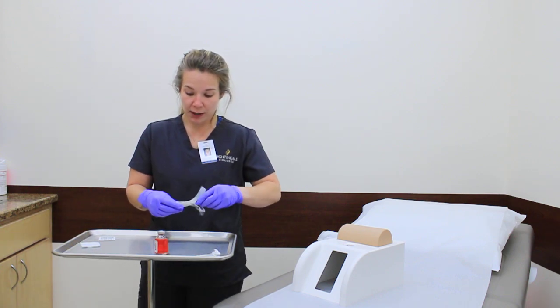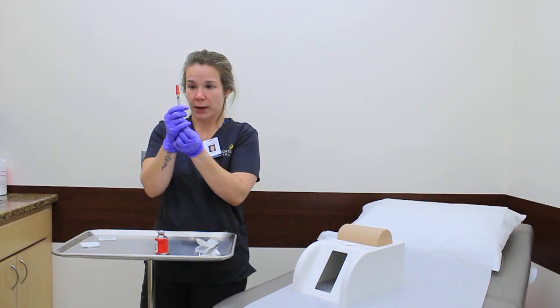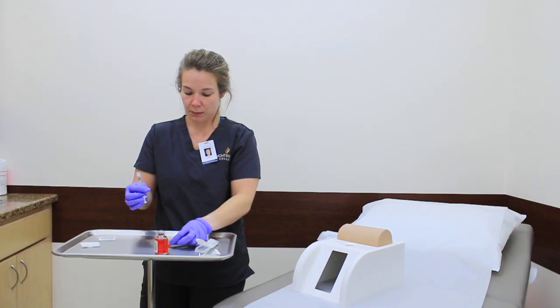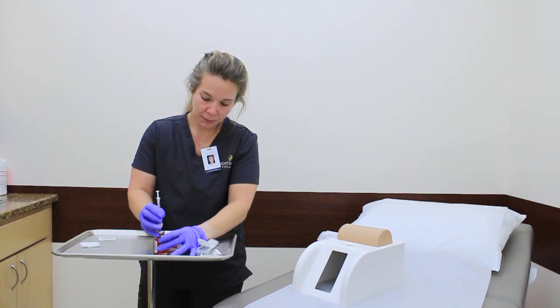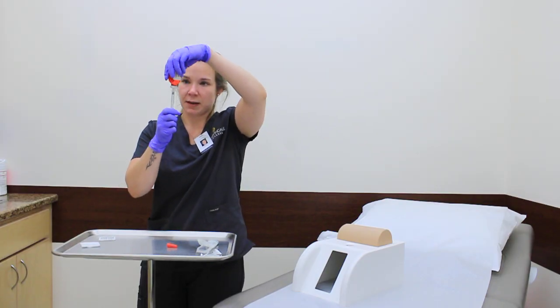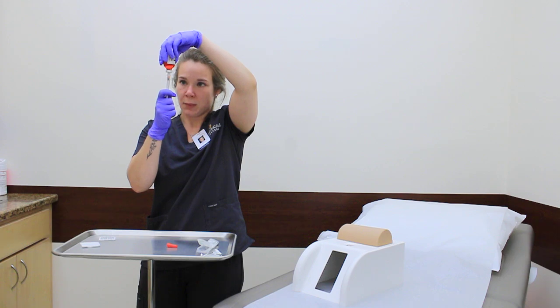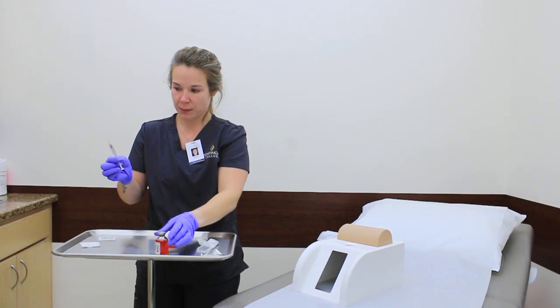So now that has dried, I will remove my syringe. First thing we're going to do is pull up 0.1 milliliter of air. And then we're going to inject the air. Taking it, flipping this upside down. Gonna pull out 0.1 milliliter of medication.